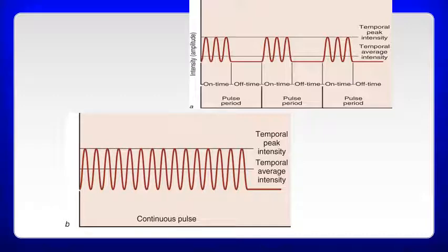So all this is demonstrating the difference. When you're talking continuous, the ultrasound energy is basically on the entire time. As you're delivering the ultrasound, you get this continuous pulse that's happening, and over time, the energy will build up and you'll get a temperature increase. So based upon your frequency, your intensity, and your time, you'll get a certain degree of temperature increase above baseline.